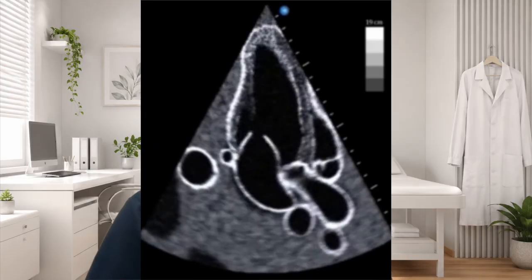Throughout this rotation, I try to keep the left ventricle in the center. Do not become obsessed with memorizing exact angle numbers. Always watch the anatomy. Keep your anatomy in mind. The right ventricle disappears as you enter the two chamber view. The aortic valve appears as you enter the three chamber view.